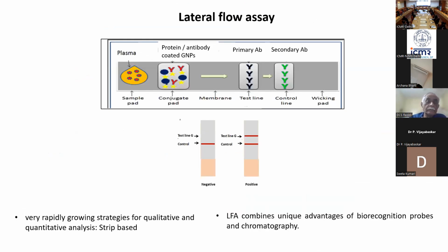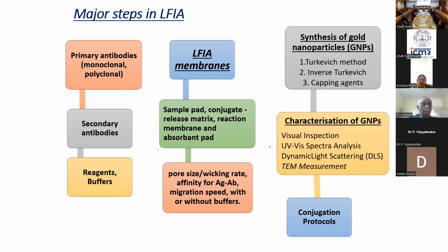So now coming to the basics of an LFI. If you are a technology person and you are into developing technology, the actual principle of an LFI is very beautiful. It's not a simple strip which you see. If you know what goes into it, it's a very beautiful way of standardizing something. So when it comes to an LFI, it basically has two unique principles. It has your chromatography and it has your antibodies, which are labeled. So it is not an easy job at all standardizing an LFI. People think it is easy, it is not.